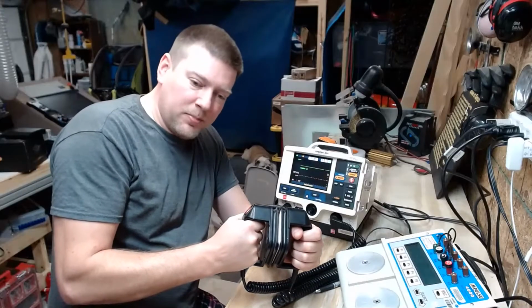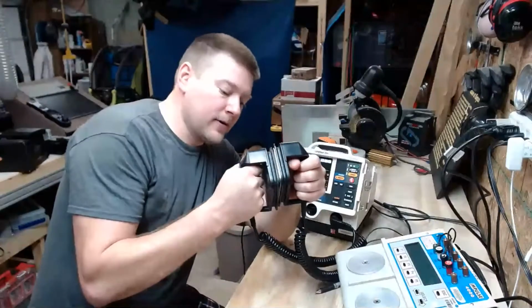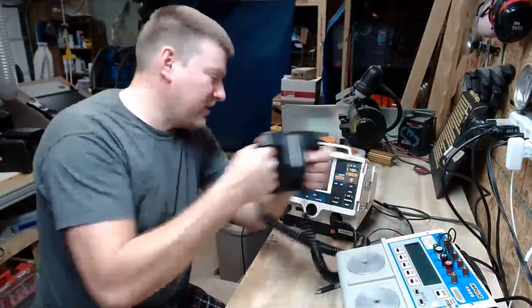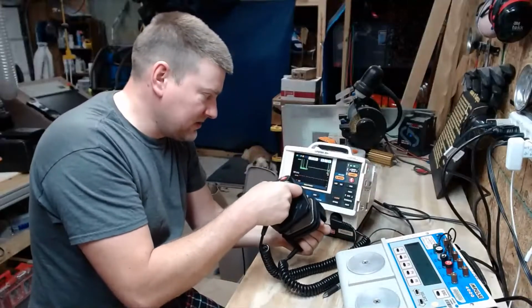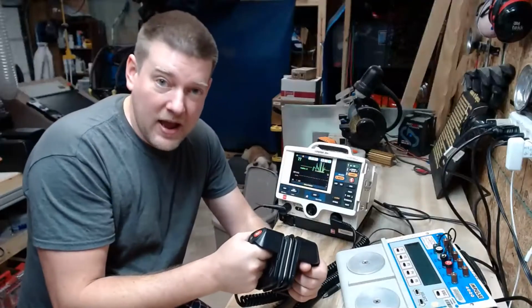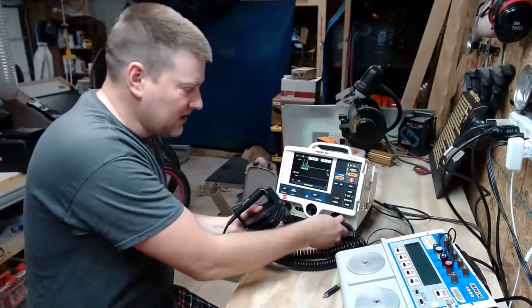You see that nice, perfect flat line that happens? So what you are doing is you are instantly verifying all the cabling and everything in between these two paddles is perfectly good. You can see I can move them around. You're not seeing any blips. See that blip? You see that stuff there? That's what happens when you have a poor wiring connection, either here at the paddles or here at the connector.